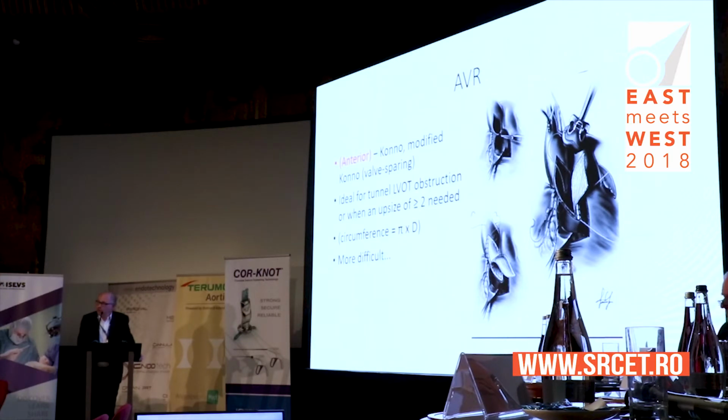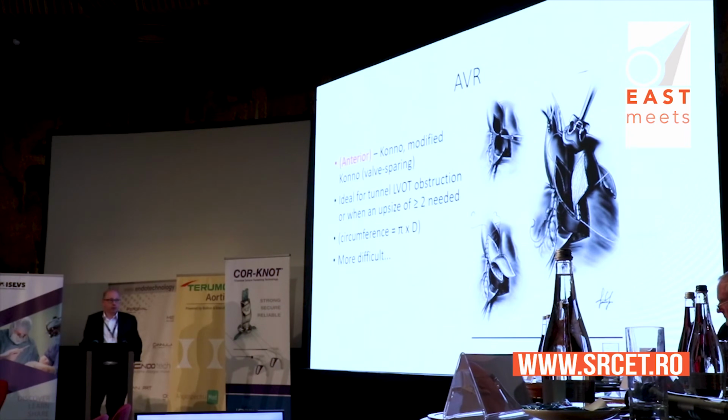If the annulus is very small, if you have LVOT obstruction, and you can see that the vertical incision on the aorta drops towards the RVOT between the 2 coronary ostia. The right ventricle is opened, and then it's the same principle. I use 2 patches, one to enlarge the left ejection pathway and another one to close the RVOT.